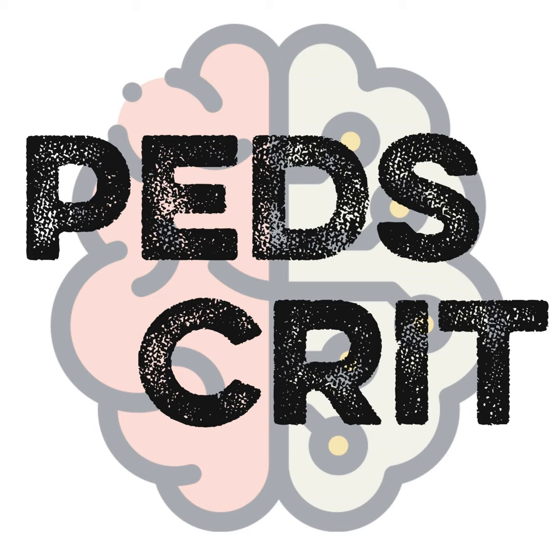Now, one way to work around it is to have a filtration-based system as opposed to a plasma exchange via a centrifugal system, which is really not any different, Zach and Alice, from a CRRT setup. It's another filter. It is available on many of the common CRRT platforms, and it does require hands-on training with repetitive simulation exercises in order to maintain competency, but it is at least similar machines that don't require interface with different devices from a nursing standpoint. But centers who actually have apheresis programs can easily offer CRRT with centrifugal TPE in tandem. Periodic teaching, training, and refresher courses are helpful, we found, in our experience.